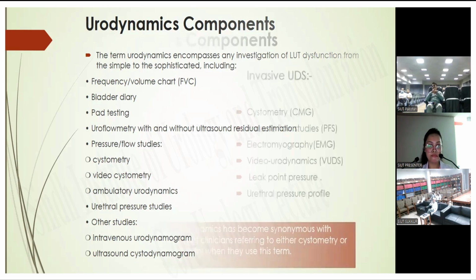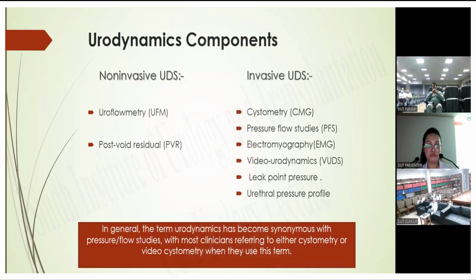So UDS is not just the UDS we have in our 4th floor suite. Just performing a simple uroflowmetry, that is also a UDS. Measuring the pre-post void residual, that is also UDS. So UDS encompasses a variety of investigations, not just what we have in our suite or in the lithotripsy setup. It is one of the components.